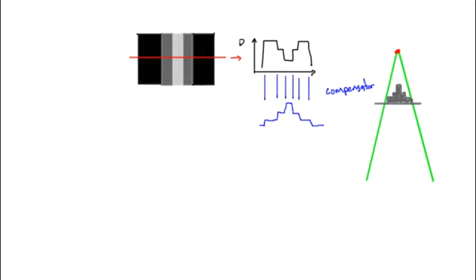So compensators were widely used in the late 1990s when IMRT was being developed. They've sort of fallen by the wayside as MLCs have taken over. But there are some real advantages to using compensators in terms of efficiency and so on, but they were never fully optimized in their design.